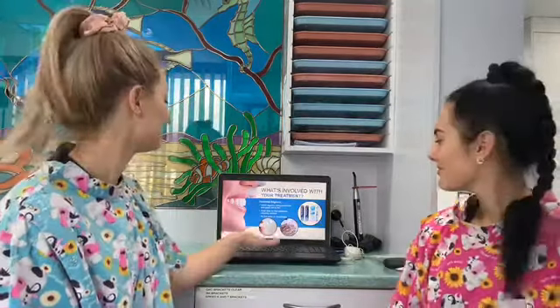We want to make sure that you don't put your aligners in any hot water because they will melt. They're only made of plastic, and don't go placing them in mouthwash either, just because they will stain and they'll go a bit of a brown colour.